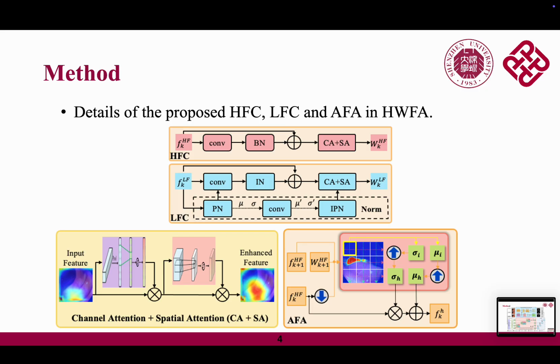Second, LFC, or the Low Frequency Calculation Unit, focuses on global structural information, since low-frequency features may also contain redundant background information. LFC uses a dedicated normalization strategy to suppress interference and emphasize cleaner global lesion cues.